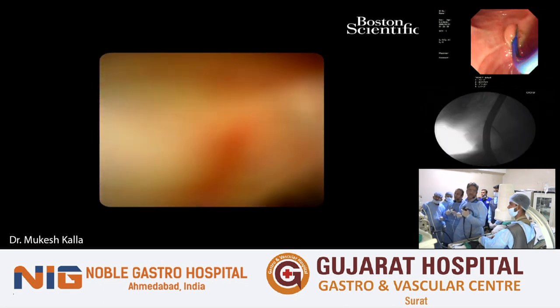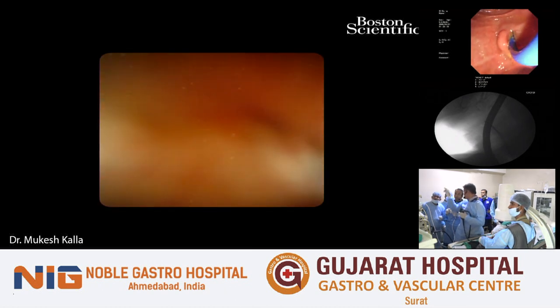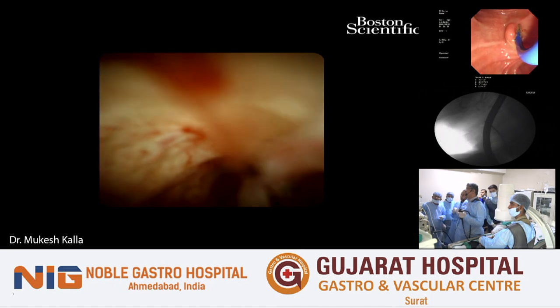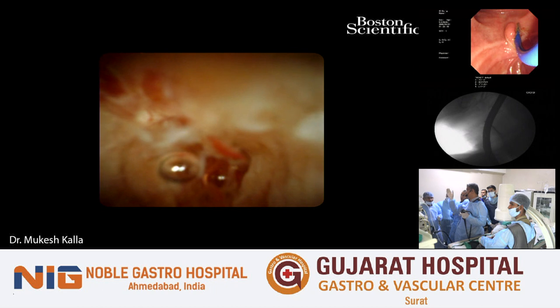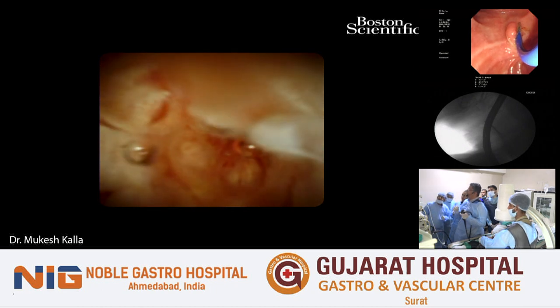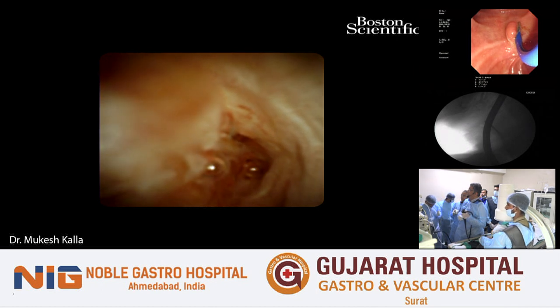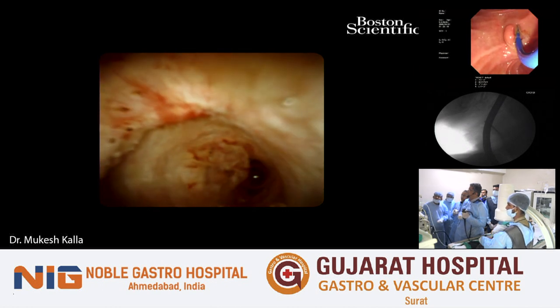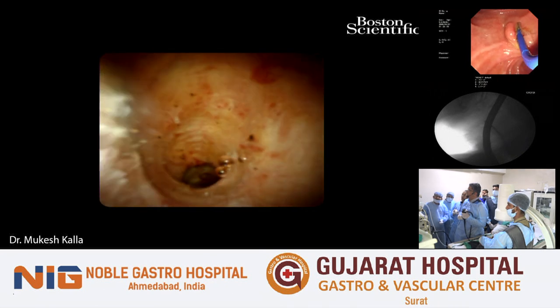Mere ko wo dekhna padega ek baar na. Mera scope kis taraf ho ja raha hai. Possible that we are inside the cystic duct, at the end of the cystic duct. Yes, sir, it seems that you are in the cystic duct. Yeah, beech mein lao. This is the end of the cystic duct, because we are against the wall now. We did a cholangiogram, the stone was here. The cystic duct was dilated. Now there is no stone in the cystic duct.